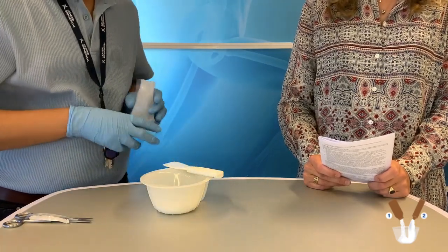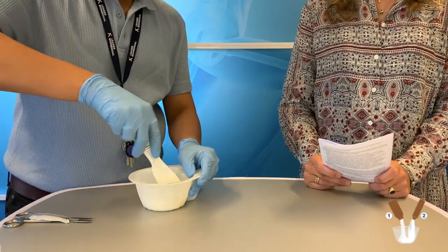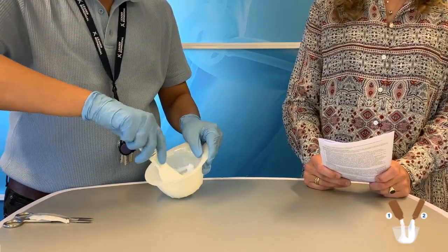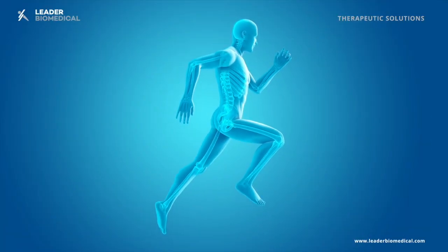After this, immediately the mixing starts with a firm grip. The cement is easy and smooth to mix, and within 30 seconds it should be a homogeneous mixture.